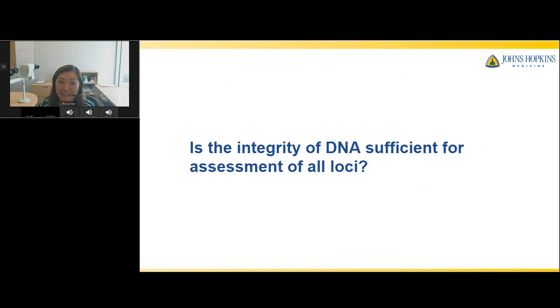So we've talked at length about the amplicon length. And obviously, the more times you're able to interrogate a single rearrangement, i.e. through redundant sequencing through framework 1, 2, and 3, the higher the likelihood of identifying a clonal sequence. And this is why IgH sequencing is redundant. However, there may be amplicon dropout, and this is typically related to somatic hypermutation, which is a normal part of B-cell development and a characteristic of both germinal center-derived and post-germinal center-derived neoplasms.